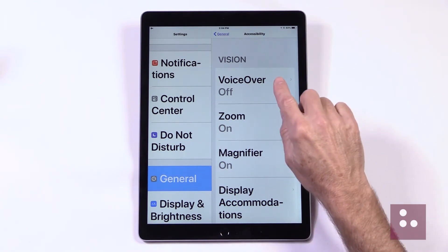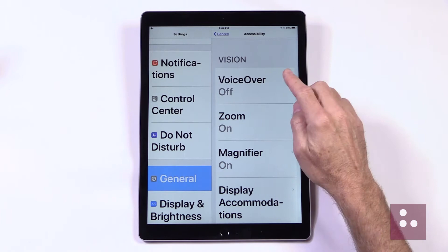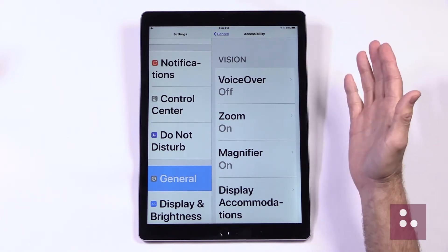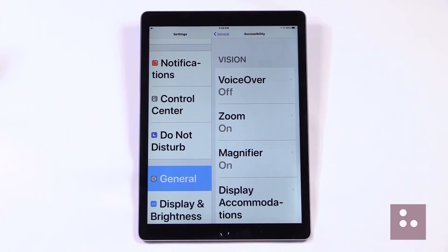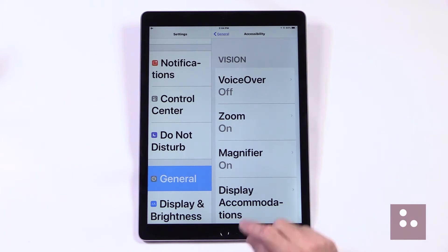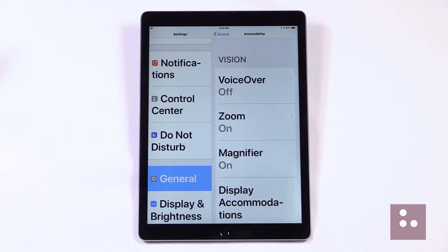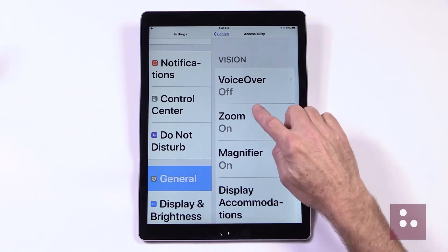We notice that VoiceOver is the first item here in our list. VoiceOver is, of course, Apple's screen reading software, and we won't be covering VoiceOver in today's demonstration because we're just focusing on our low vision features today. Zoom is the second item here in our list, and Zoom is our magnification software. Let's just touch our Zoom button to open it up.